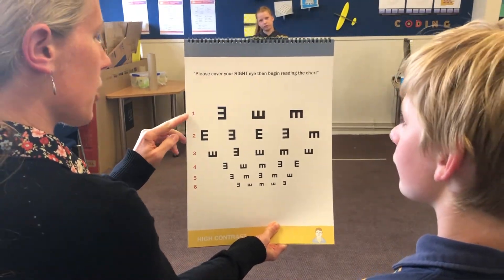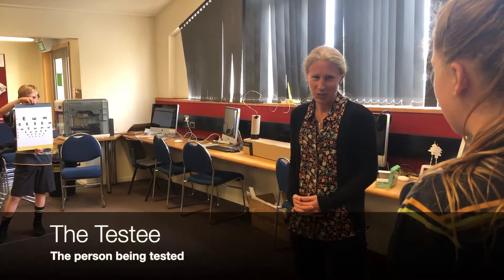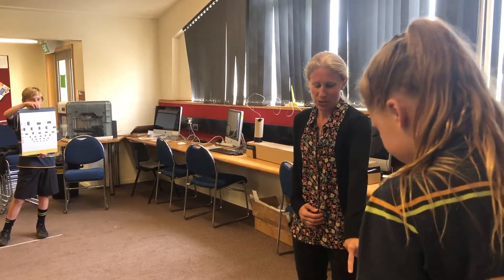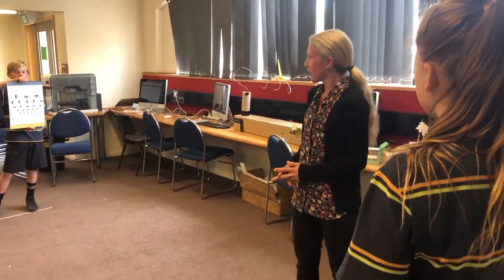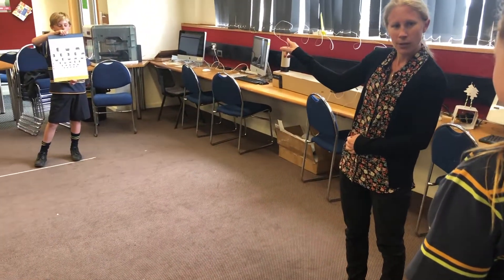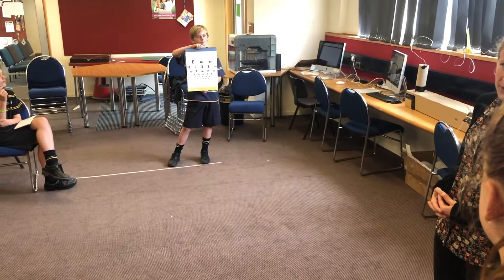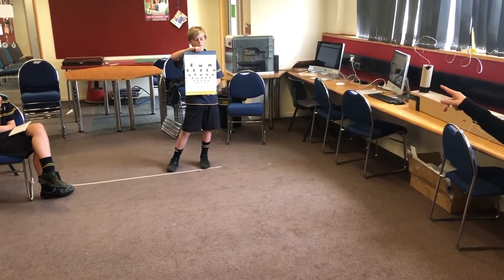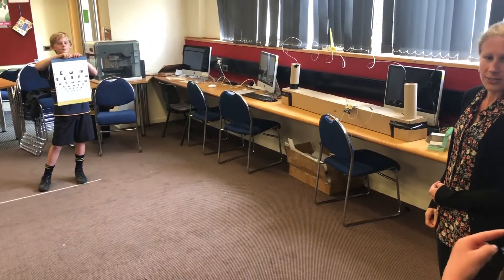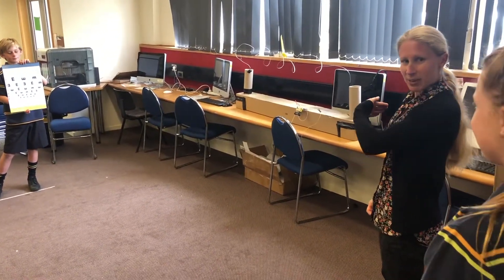If she gets a letter wrong, you can ask her to repeat that row again. Maddie, I'm going to explain to you the role of the person being tested. You're standing just behind that white line. Can you see the chart that Ethan's holding up — the E's? What you're going to do is point in the direction that the limbs of the E's are facing. For example, the first E on line one — which direction are the limbs facing? Right. That's right. So you're going to point really clearly and really slowly.